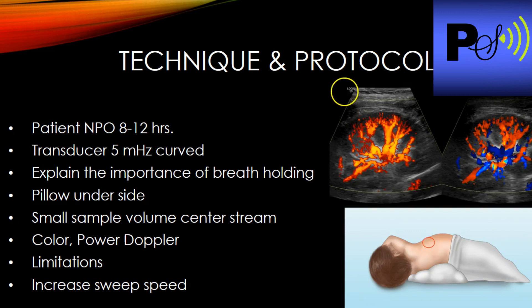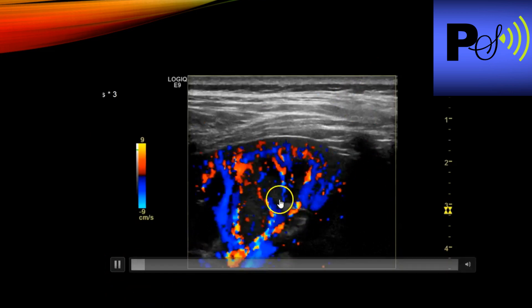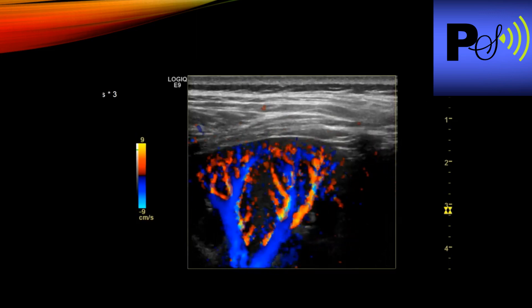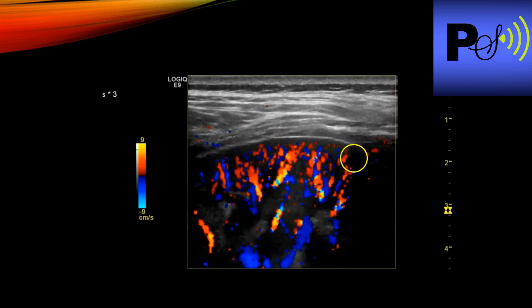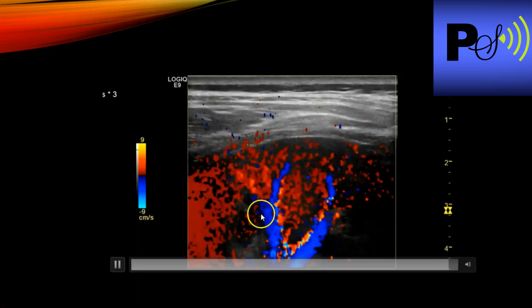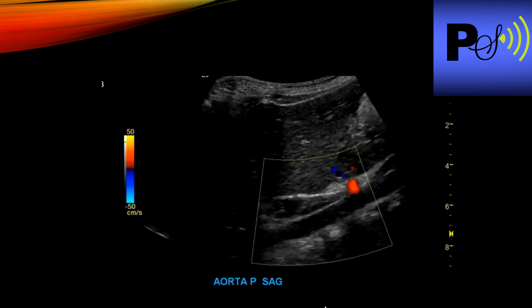Breathing is critically important in this exam. As the patient breathes, the vessel moves in and out of the sample gate, causing the waveform to come and go. If the patient has COPD and can't hold their breath, it will be very difficult. Increasing the sweep speed helps. Instruct the patient to hold their breath and maintain it for a considerable amount of time.